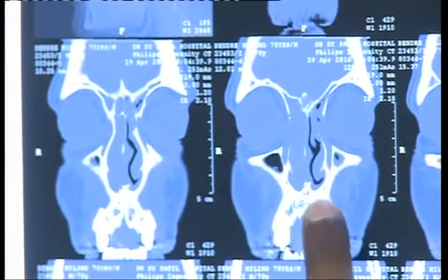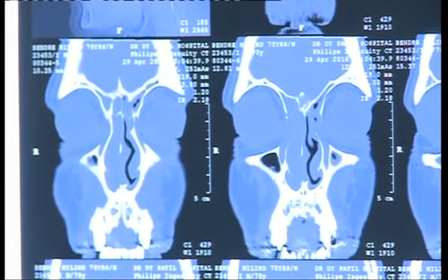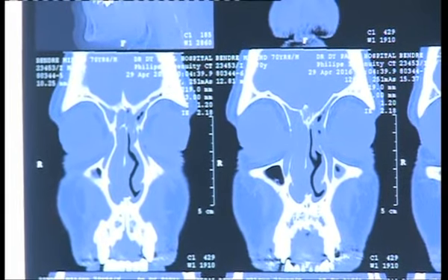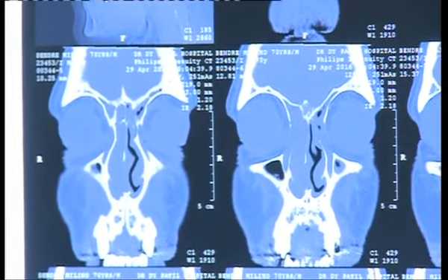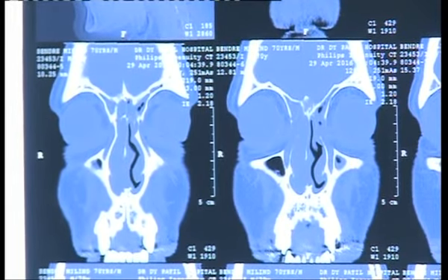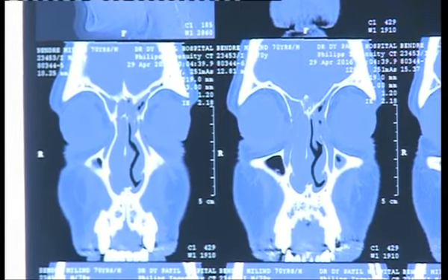See that this is the frontal recess. I always insist that you have this measurement, and you have the measurements posteriorly as well. So this is going to be the width in which you're going to operate. I always look at the width of this versus this.